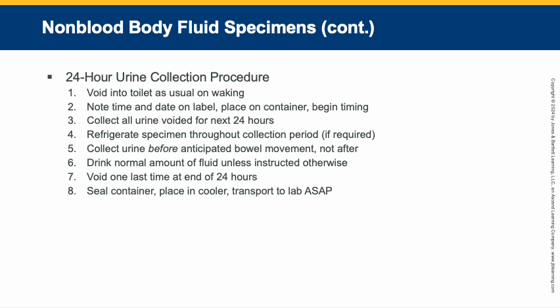Step number 1, they are going to wake up, start the time for the 24-hour mark, but they're going to void into the toilet just like they always do when they wake up. And then they're going to note the date and time of starting on the container, but they're not going to void into the toilet anymore for 24 hours.